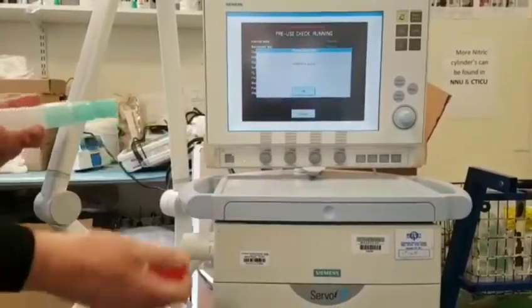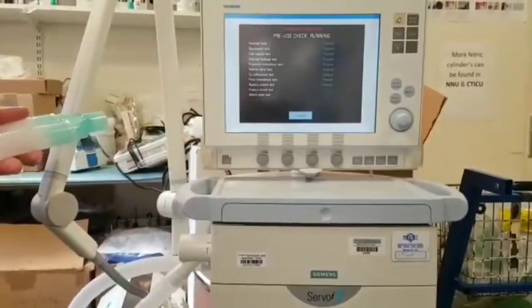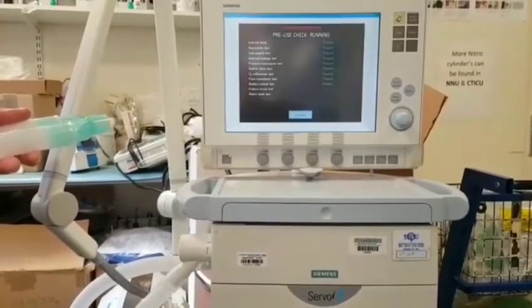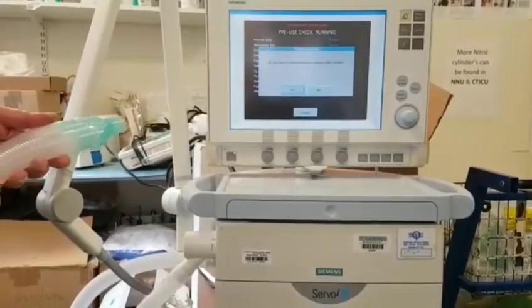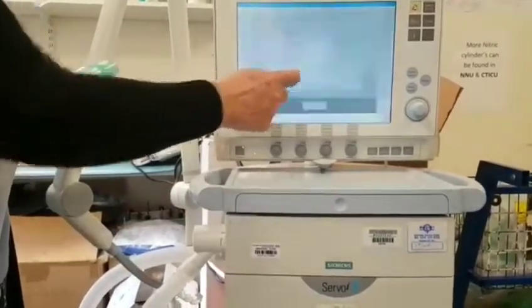It's asking me to unblock the wye piece, so I say OK. And then it's asking me, do I want to compensate for compressible volume? New circuit and new patient, so I say yes.